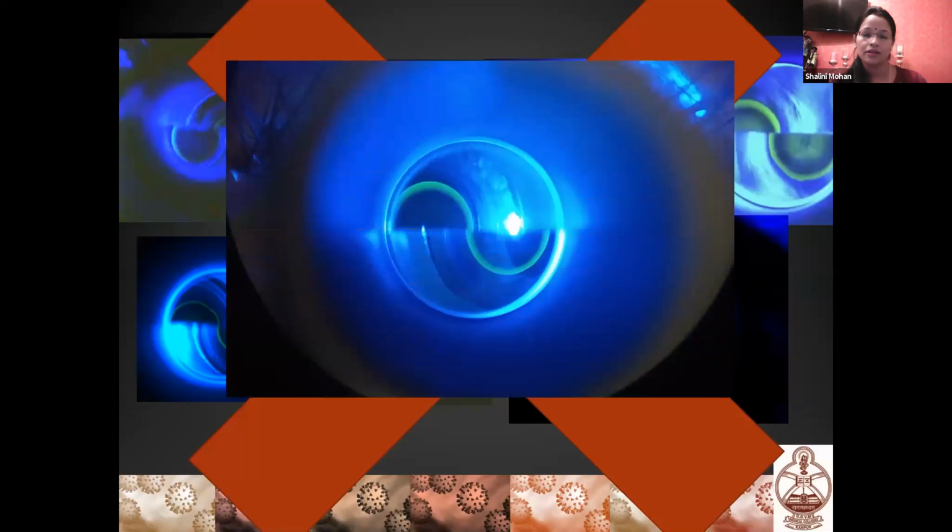So what is ideal? This is the ideal scenario, when we get adequate thickness of the circles along with proper semicircles being inside the prism, which you can see. So it comes with experience.